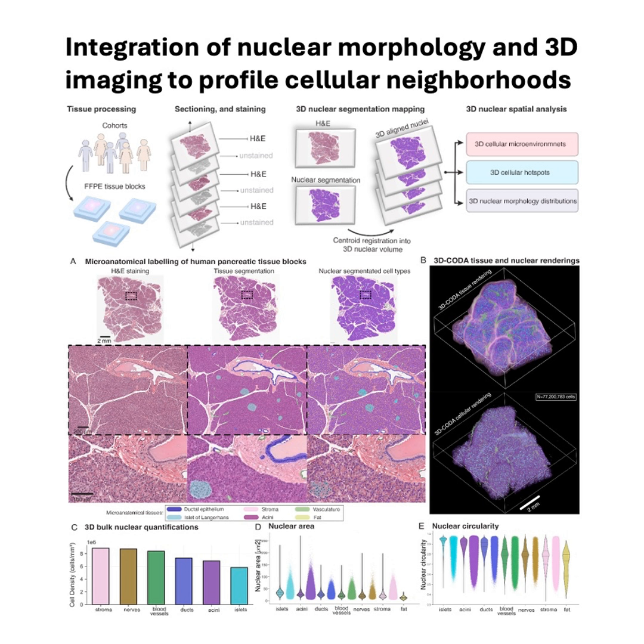4 micrometers. How thin is that? It's roughly 1/10 the width of a human hair. Super thin. Wow. And they created hundreds of these ultra-thin sections. Then every 4th section was stained with H&E, that classic pink and purple stain, and then digitized at high resolution, 20x magnification. So now you have hundreds of individual digital pictures, like pages in a book.